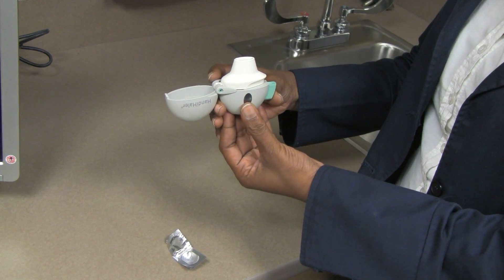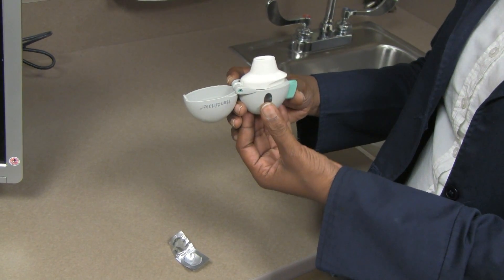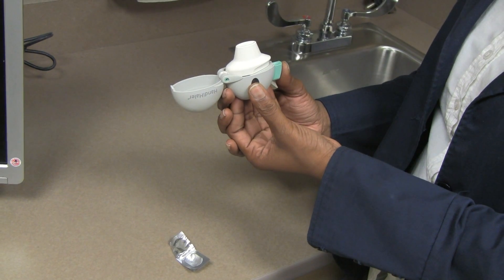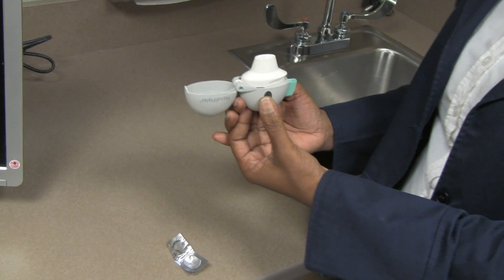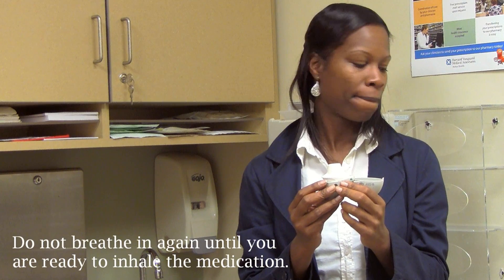Hold the device with the mouthpiece facing up and press the green piercing button once only. This makes a hole in the capsule which allows the medication to be inhaled. Exhale fully away from the inhaler.